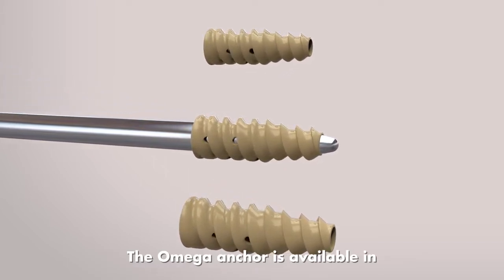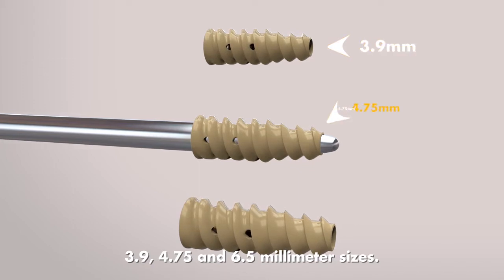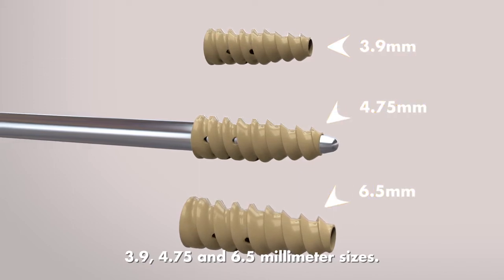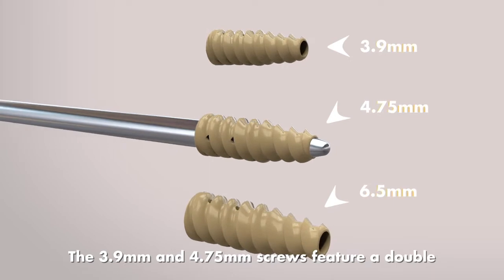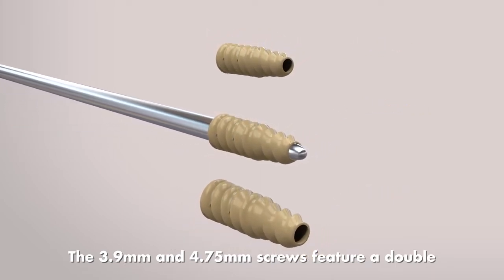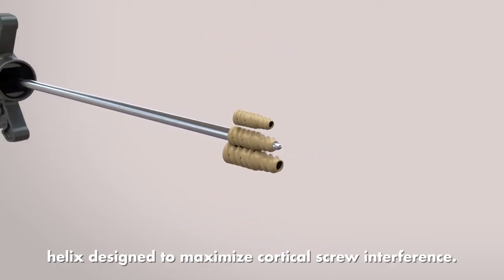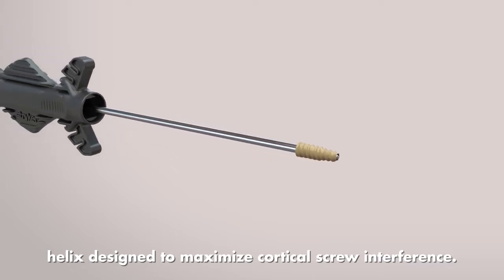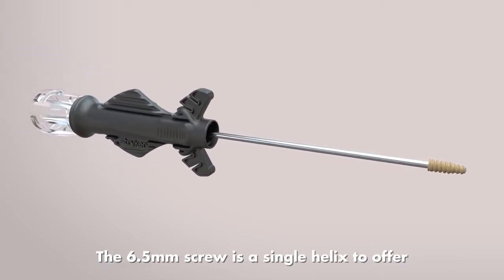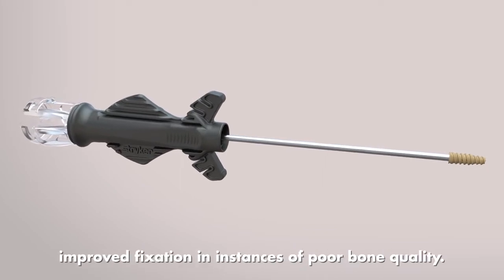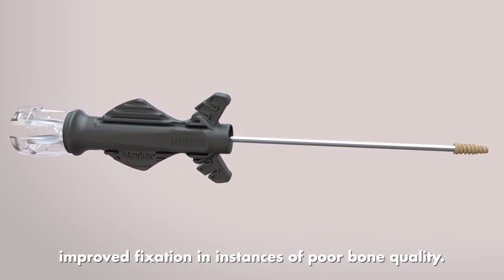The Omega anchor is available in 3.9, 4.75, and 6.5mm sizes. The 3.9mm and 4.75mm screws feature a double helix designed to maximize cortical screw interference. The 6.5mm screw is a single helix to offer improved fixation in instances of poor bone quality.